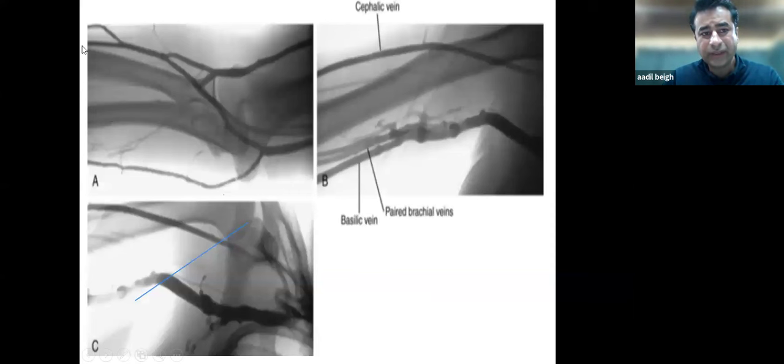So, for example, this is the angiography. It is showing the cephalic vein of the forearm, basilic vein of the forearm. There's a median cubital vein, and the cephalic vein is running and going as a basilic vein. Then one branch from the deep system is forming the median cubital vein. This vein is joined by this vein and forms the cephalic vein of the arm. So this is the basilic vein. Then this cephalic vein forms the cephalic arch, and then it is joined by this basilic vein, forms the axillary vein, forms the subclavian vein.